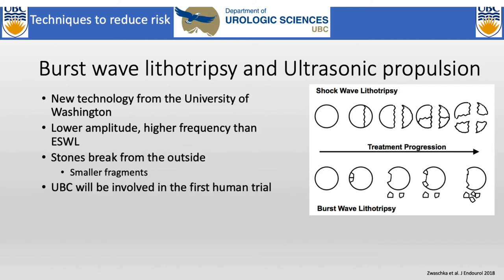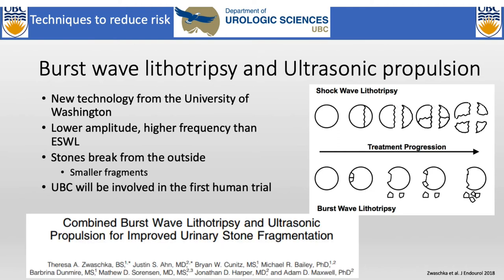It hasn't been done in humans yet, but Dr. Chu will be involved in the first study, and I'm not sure how soon that will be opening up, but they've done a number of studies in the lab so far. There's also ultrasonic propulsion, so the ability to actually move stones from one position to another in order to treat them or in order to aid in stone passage. And so the same people at the University of Washington have looked at combining these two technologies to get the stone into a good position, meaning usually out of the lower pole, and then break it down.